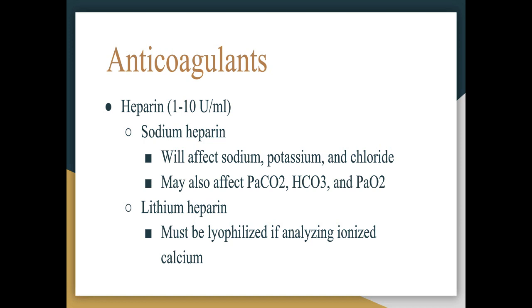A study performed in client-owned dogs showed significant changes in CO2, base excess, and lactate, calcium, and potassium levels, all decreased using liquid sodium heparin. This was especially pronounced with 0.1 milliliters of heparin used per milliliter. There have been conflicting study results on whether pH and PO2 are more significantly affected. However, sodium heparin solution has a pH of 6.4, a PCO2 of 7.5, and a PO2 of 160. So it would not be surprising that overusing the amount of sodium heparin via dilution could cause significant changes in those values.